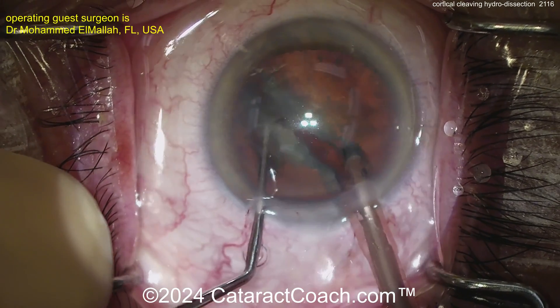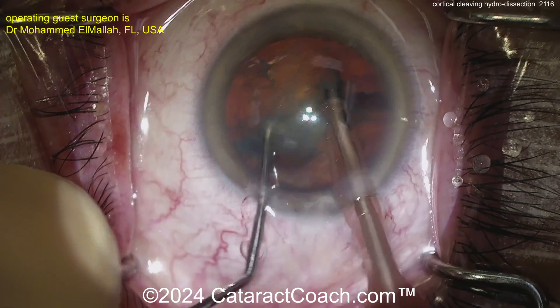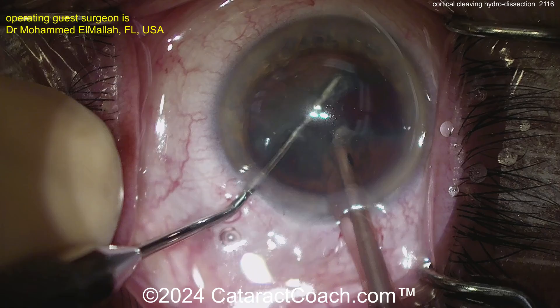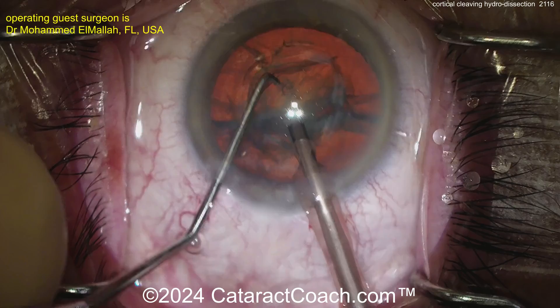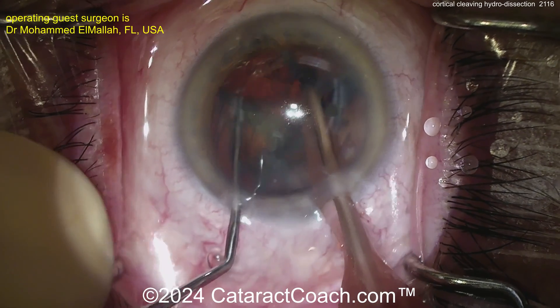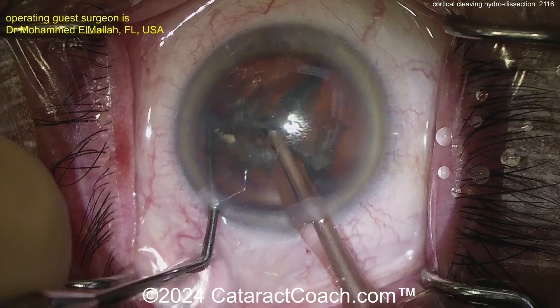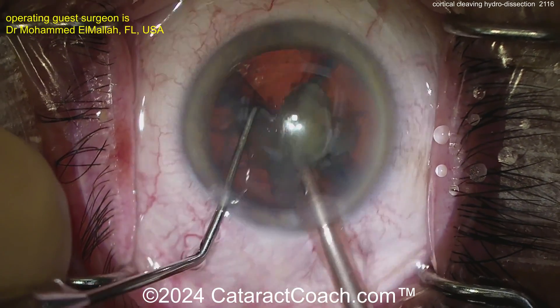I first met Howard Fine maybe more than 20 years ago at meetings. I even did a trip with Howard Fine to Vietnam in 2006. He was a truly amazing doctor to learn from — so many great pearls, and he was prolific in our field. He's since retired to Eugene, Oregon. He talked about and published Cortical Cleaving Hydrodissection, a way of using just the BSS cannula to separate out all that cortex.